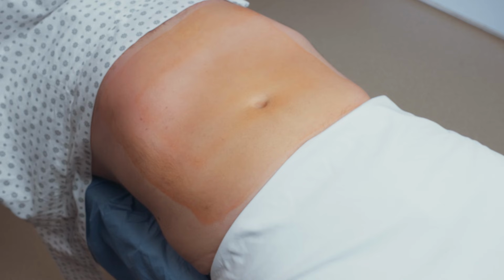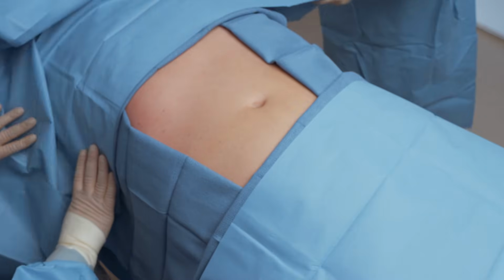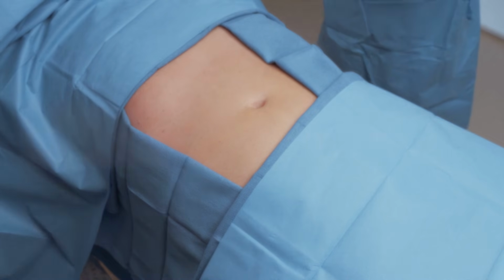As the solution dries, the sheen becomes less apparent and takes on a matte appearance. For optimal adhesion, make sure the area is completely dry before applying drapes or dressings and before using an ignition source such as a cautery or laser.